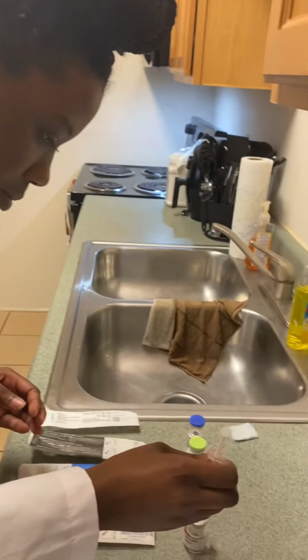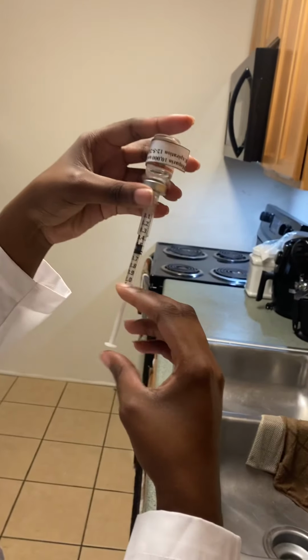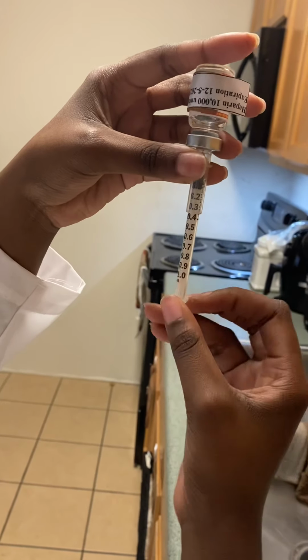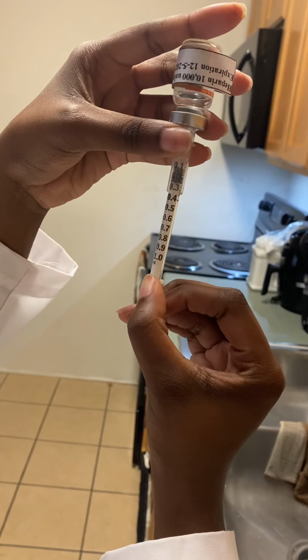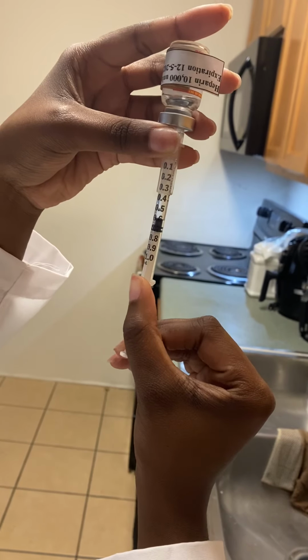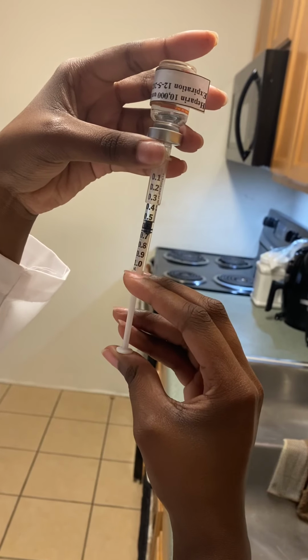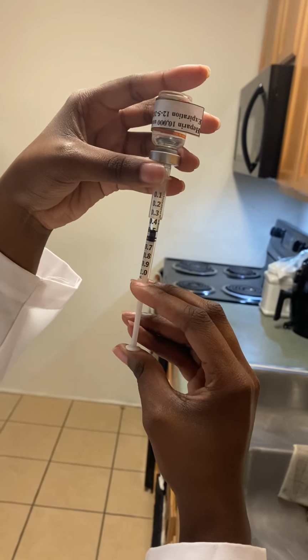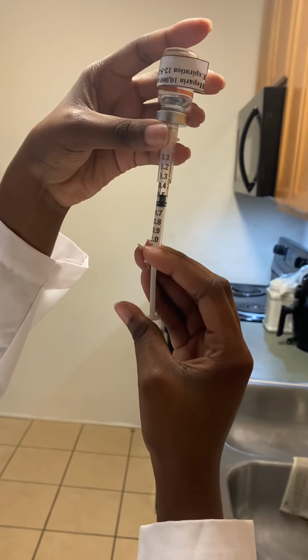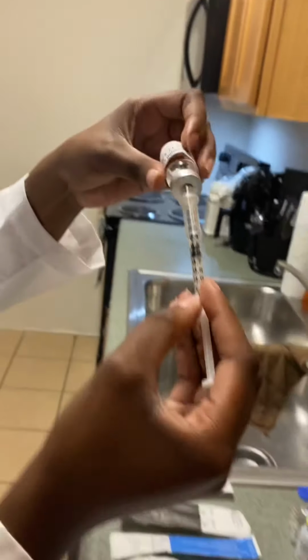Okay, and I'm going to insert it into my heparin. Going to push all of my air in. Pull out my heparin, and I'm going to pull out a little extra to get rid of any air bubbles that I have. Okay, and get up to 0.5 there, and I see that I am at 0.5 with no air bubbles, and you can see there 0.5.